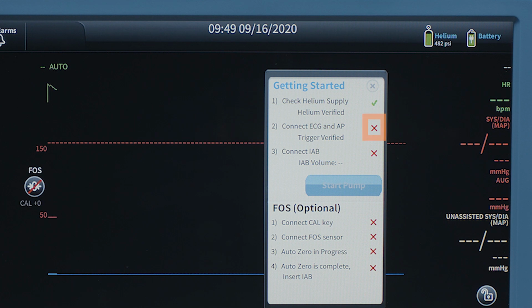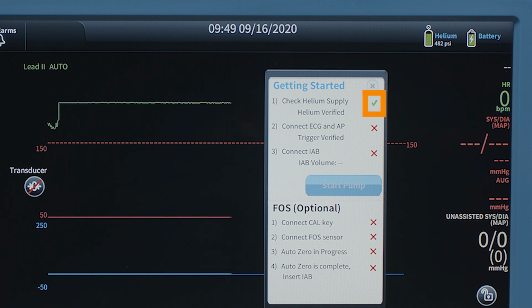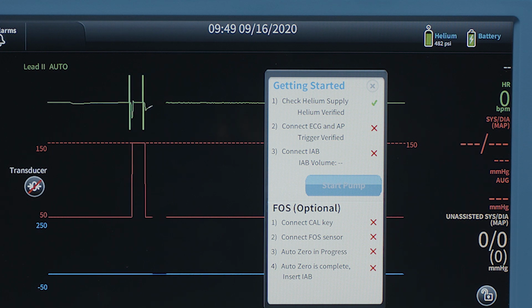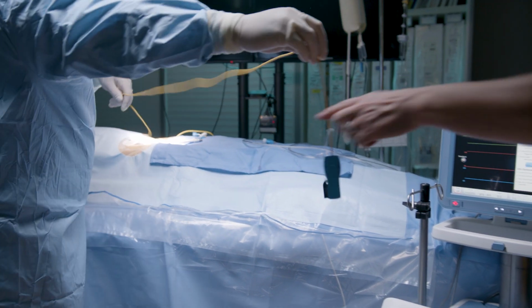A red X next to an item indicates that item is not ready and further action is needed. A green check indicates that an item is complete and no further action is needed. The checklist provides an additional set of steps to assist in connection and zeroing of the fiber optic sensor. The scrub technician will hand off the fiber optic connections.